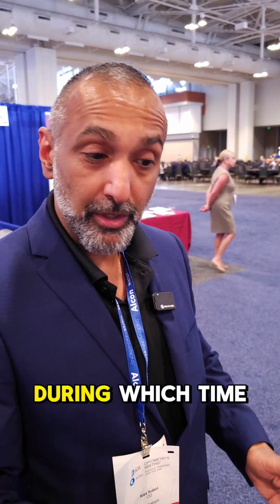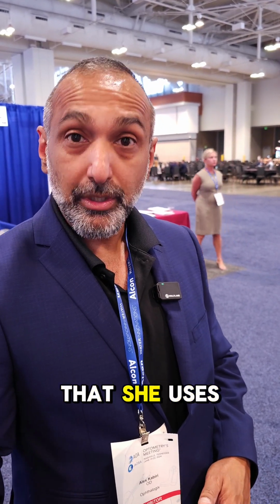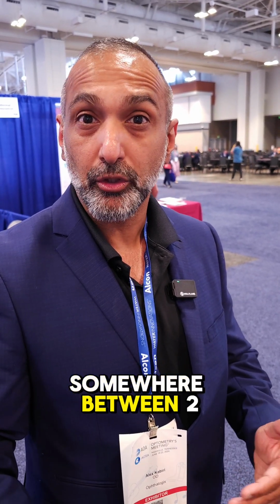Now, if we were in the office, I'd tell her to keep her eyes closed for about a minute or so, during which time I'd spin around, finish my chart notes, send what I want to send to the pharmacy, which is likely going to be a non-preserved artificial tear. I'm going to suggest that she uses it every 3 to 4 hours while awake for the duration of treatment, and I'm going to probably send either Tobradex generic, Tobradex ST, or Maxitrol drops, 1 drop to the affected eye 2 to 3 times a day for the duration of treatment, which is usually somewhere between 2 to 7 days, somewhere in that range, depending on who and what we're treating.